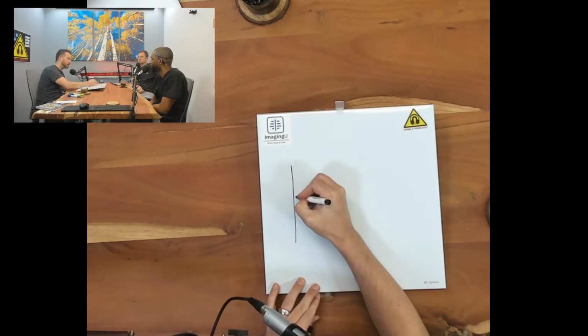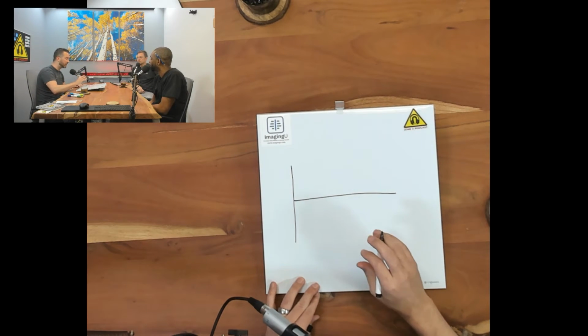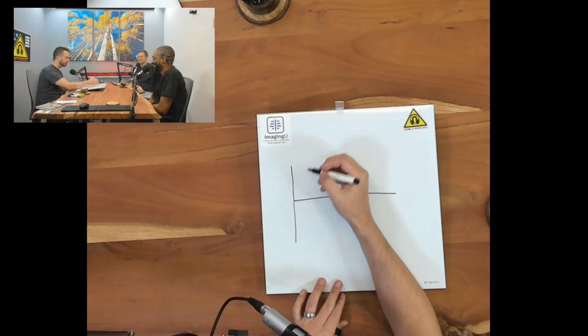So what's going to happen? We do give a 180-degree pulse, which spins everything down to the negative B0. But the thing about it is that we see things like this. I've got friends of mine that specifically make fun of my drawing, and they take pictures of things and create Christmas cards with it. It's awful, but it's probably going to happen here.